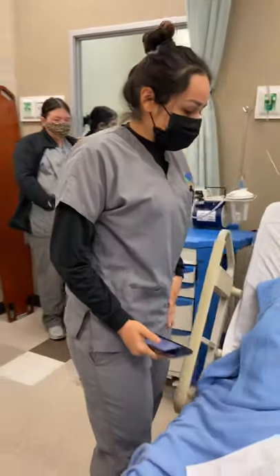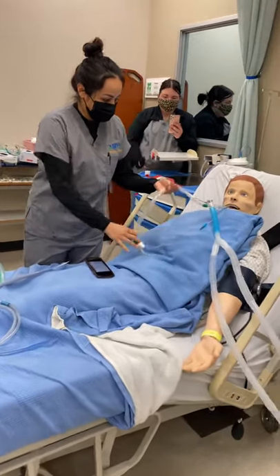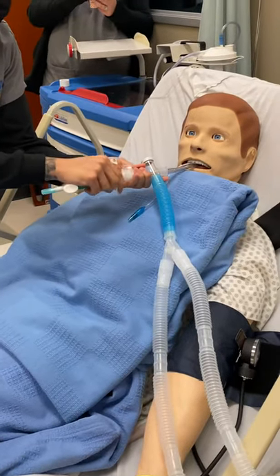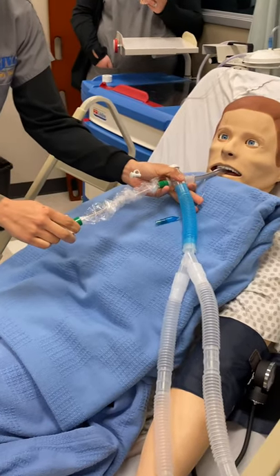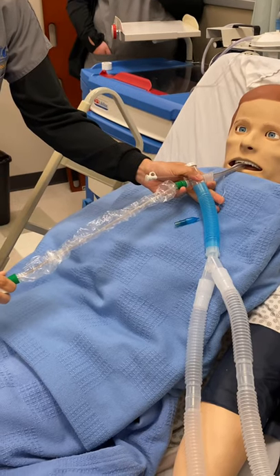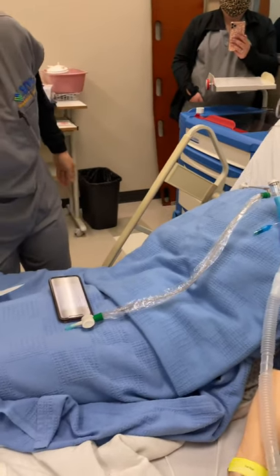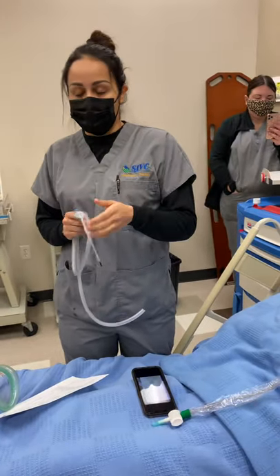So the first suctioning that we're going to do is the inline suction. And then we're going to use our catheter. So first it's the inline suction, then it's the catheter, and then the last one would be the yonker.